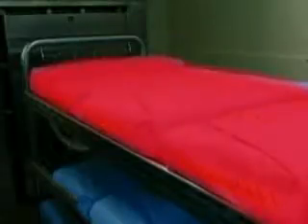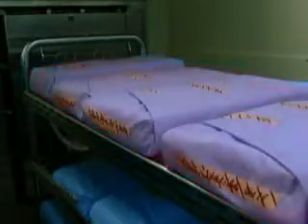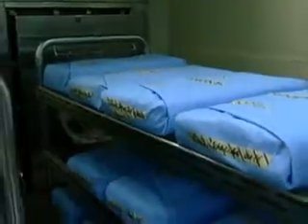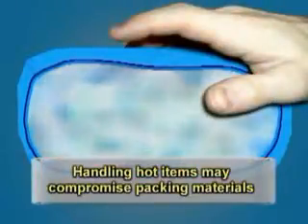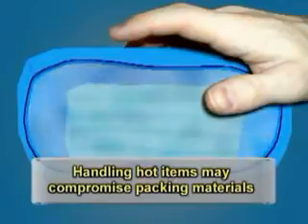Steam sterilized items must be allowed to cool thoroughly before handling or removing from the sterilizer cart. Items might still contain steam vapor and condensation. If handled, there is a potential for compromising the barrier properties of the packing materials.